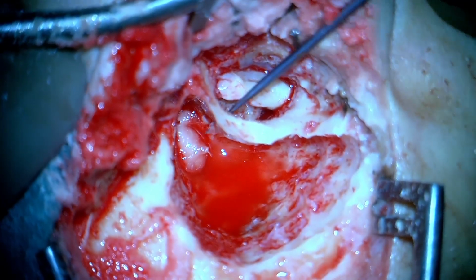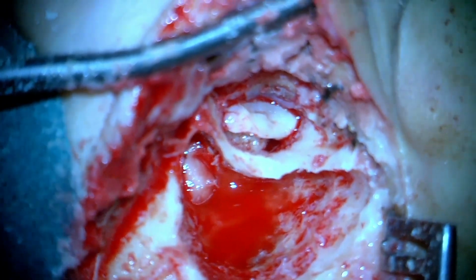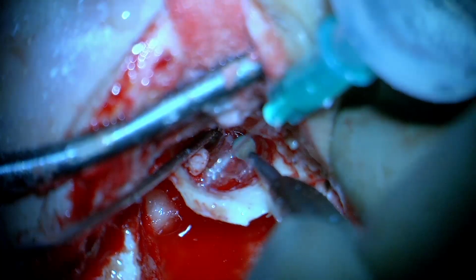And you see how this defect is pretty big actually, and would need to be reconstructed in the end once complete disease removal is ensured.